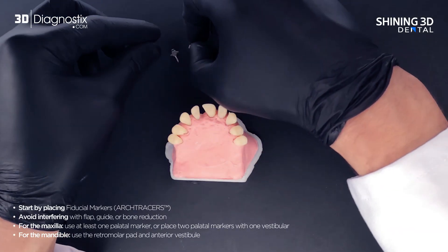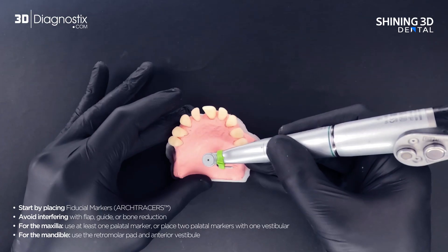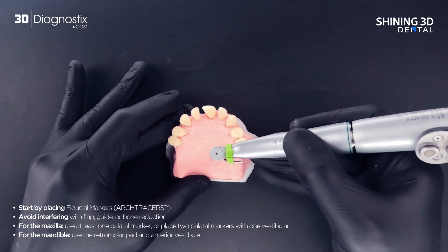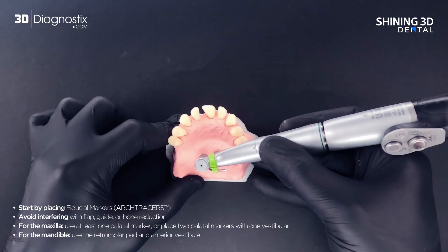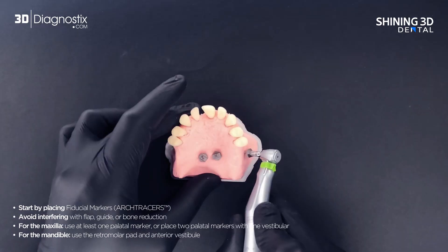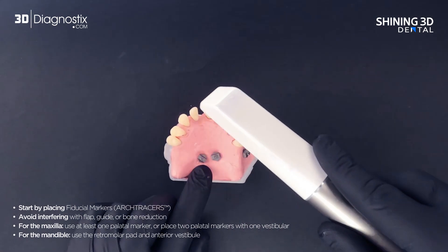On surgery day, start by placing fiducial markers called arch tracers for photogrammetry registration. For the maxilla, use at least one palatal marker, or place two palatal markers with one vestibular. For the mandible, use the retromolar pad and anterior vestibule.